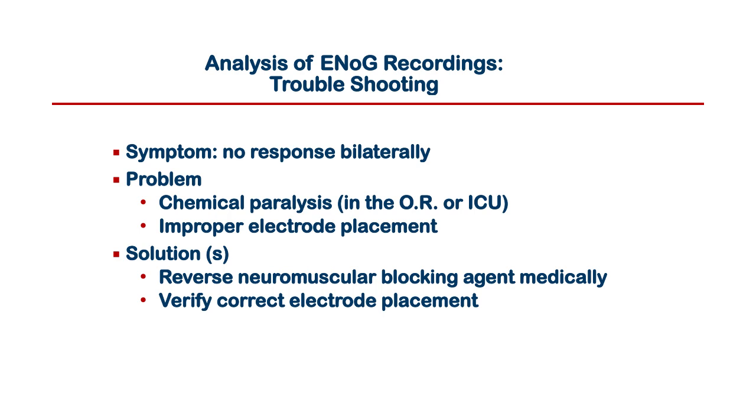Or maybe, and here's a more likely explanation, certainly in clinic, you've got the electrodes on the nasolabial fold on each side, the right and left, and you're stimulating the right stylomastoid foramen near the right ear, but you're actually trying to record a response from the electrodes on the left side of the face. Well, you'll never get anything because this is all an ipsilateral response.